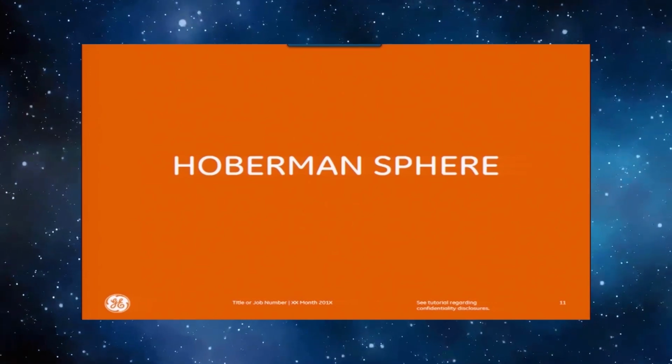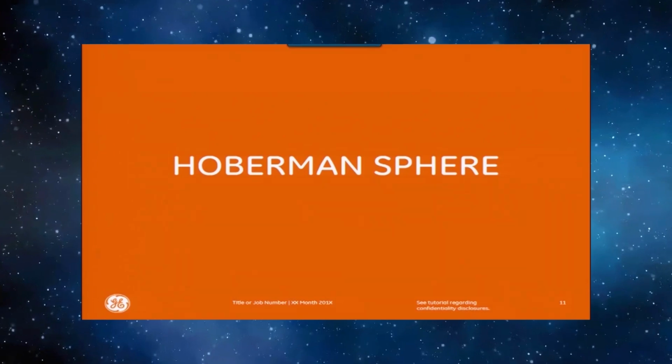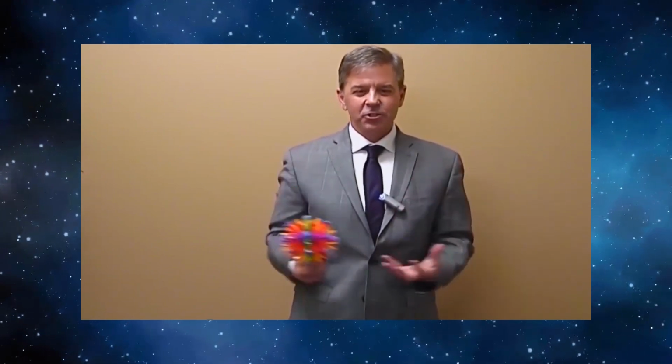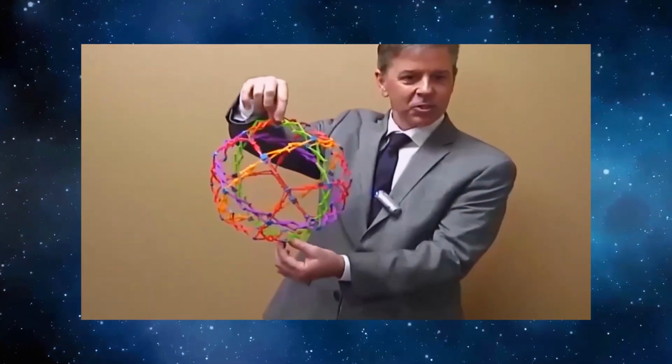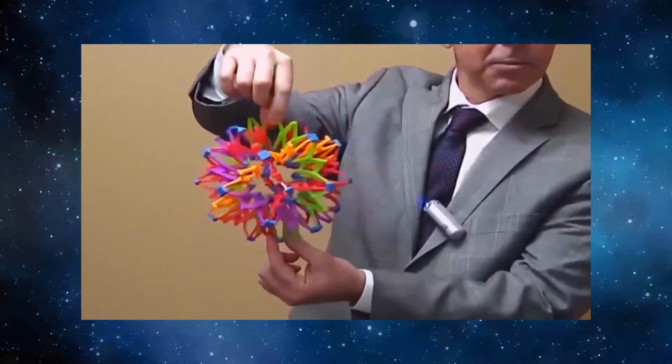So one of the best ways to illustrate what strain is and how to apply it to the heart is to use a toy called the Hoberman sphere. So a very good way to get a very good intuitive understanding of exactly what strain is to use this little thing here. It's a toy called a Hoberman sphere. And the way we're going to use this is we're going to look at this Hoberman sphere as it contracts down and expands back out.